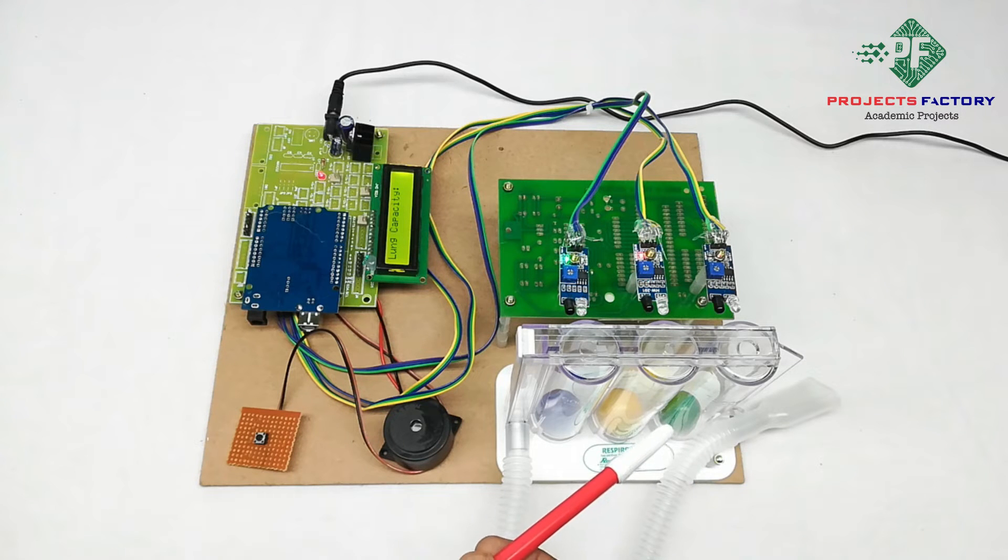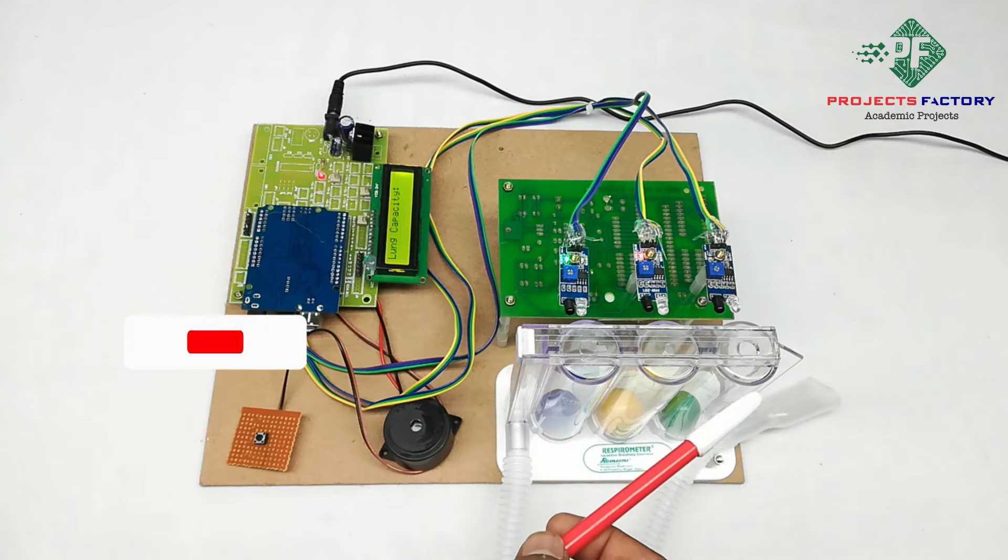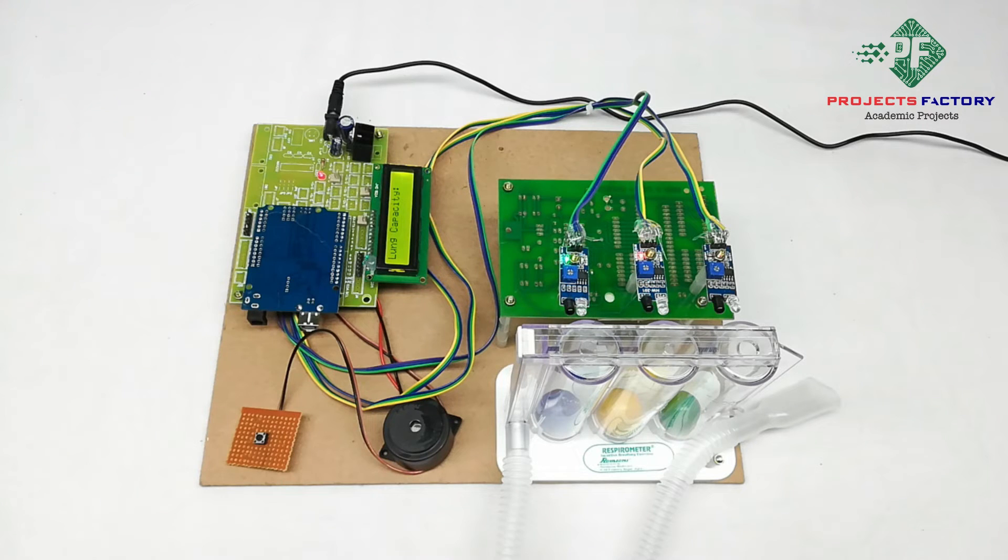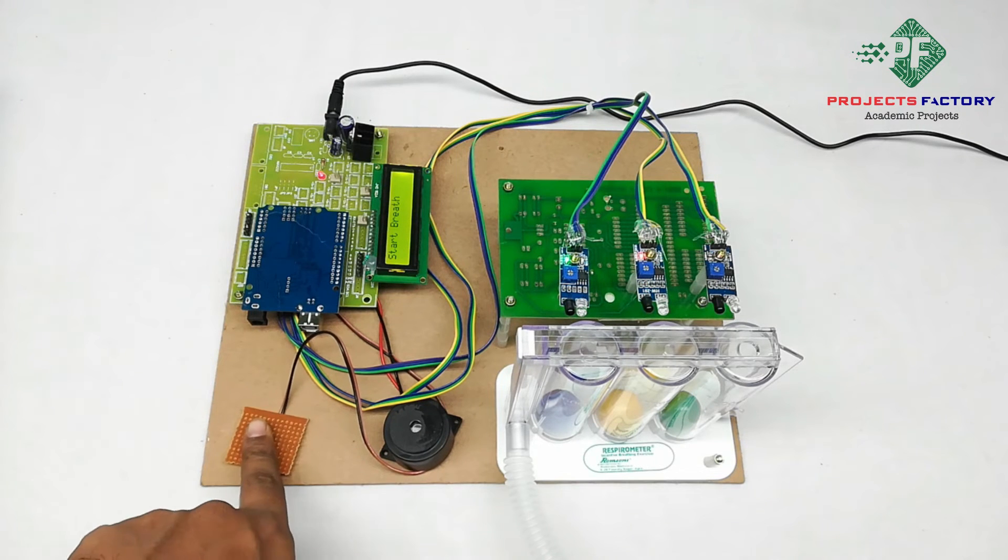Based on the ball's displacement, it calculates CC of lungs. For first ball: 600 CC, first and second ball: 900 CC, all three balls: 1200 CC. The buzzer will turn on to indicate holding time, then we press the button.